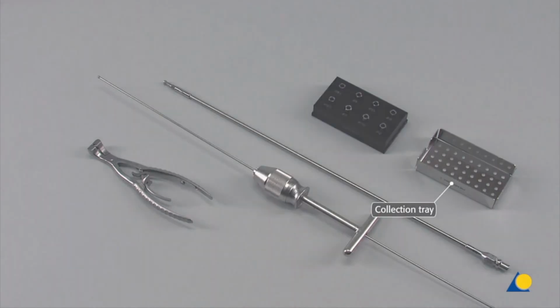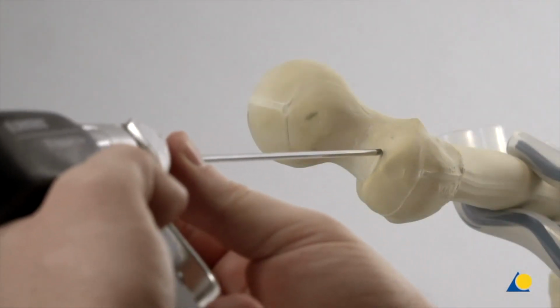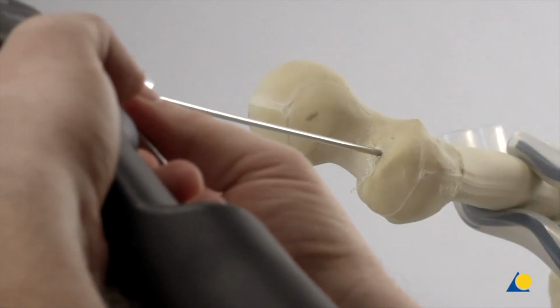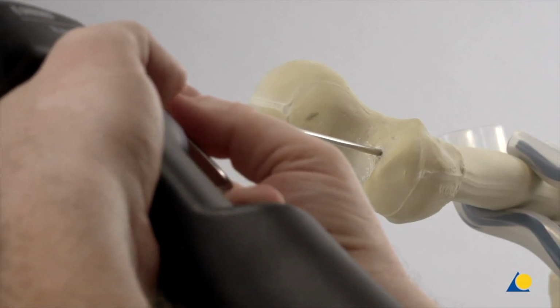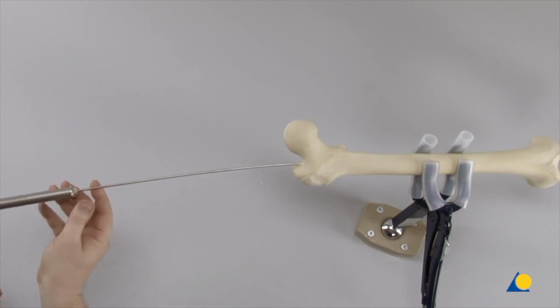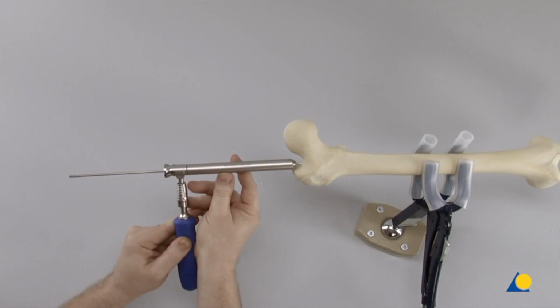the collection tray. The guide wire is inserted and its optimal position is confirmed under image intensification in both AP and lateral planes before continuing the procedure. The handle, protection sleeve, and the multi-hole drill guide are assembled, and the assembly is inserted over the guide wire through the incision to the bone.